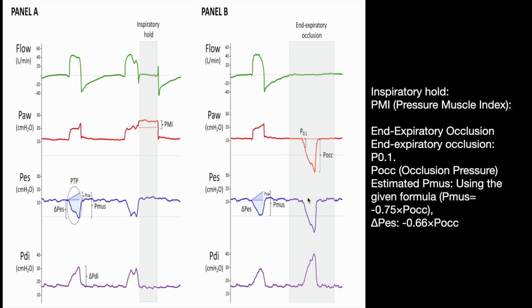If the muscle strength is good and the drive is good, then I can slowly wean the patient. However, in the early stages, if my respiratory muscle use is more and my effort is more, then I need to probably sedate the patient or change my ventilatory settings in a manner to reduce the various parameters.